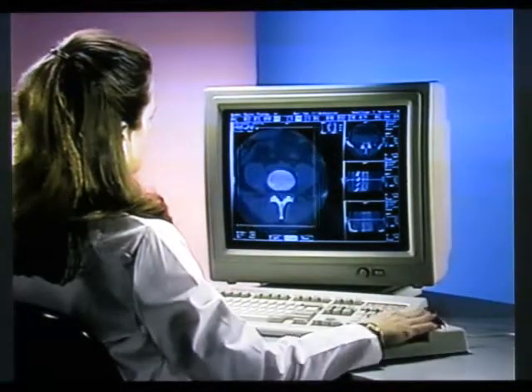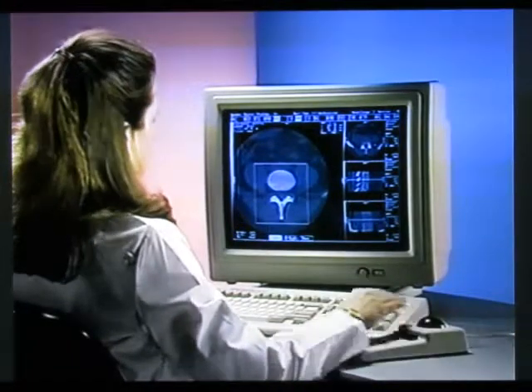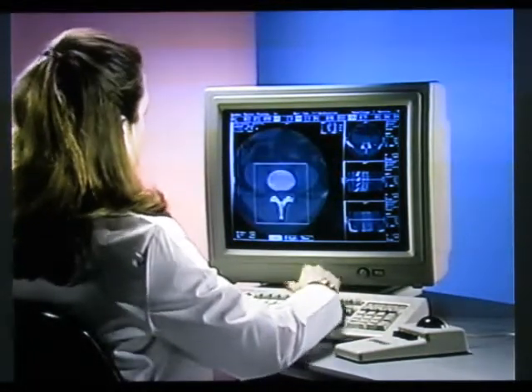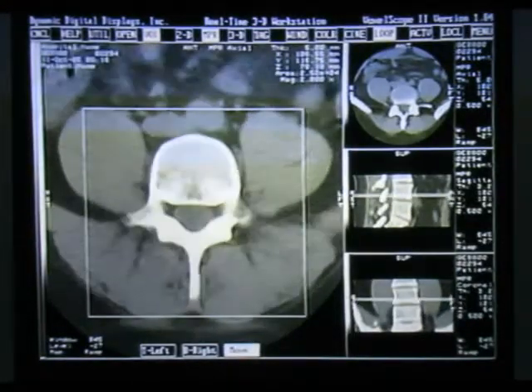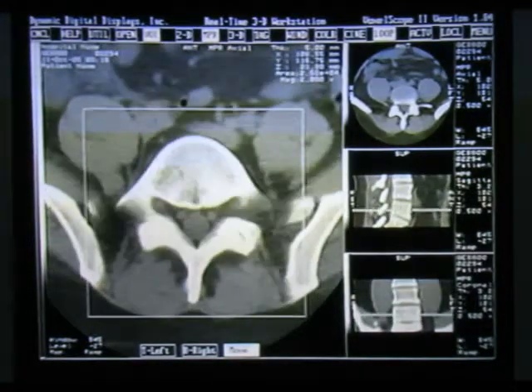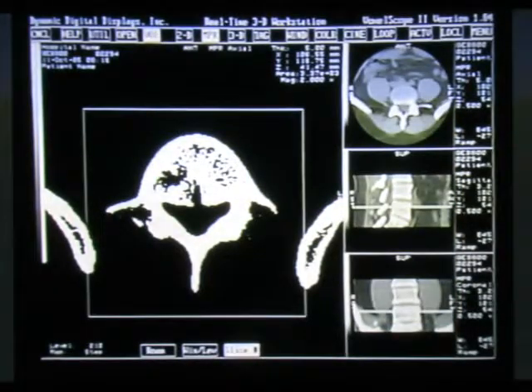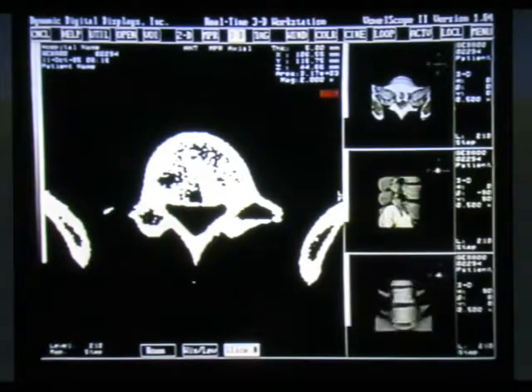Using a 3D box, a volume of interest may be set to remove unwanted tissues or artifacts, or to specify that part of the image containing the pathology. A cine mode allows rapid viewing to assure proper positioning of the box relative to the anatomy. A predefined threshold can also be selected, bone in this case. Then, by pushing just one button, 3D images are instantly created.